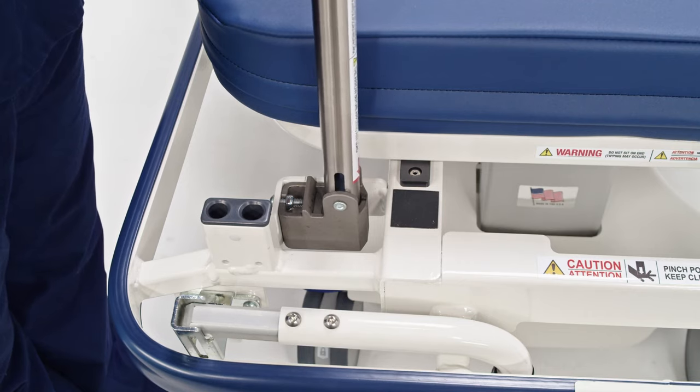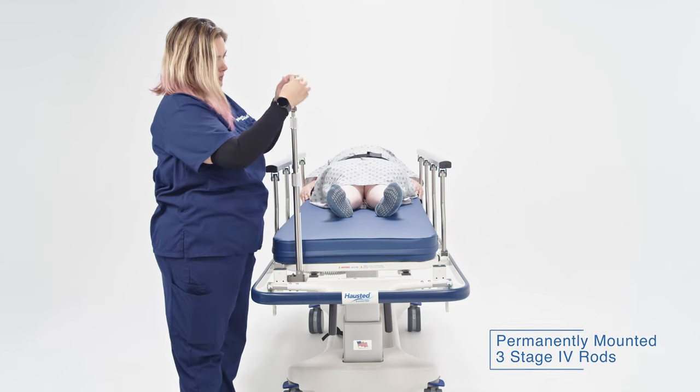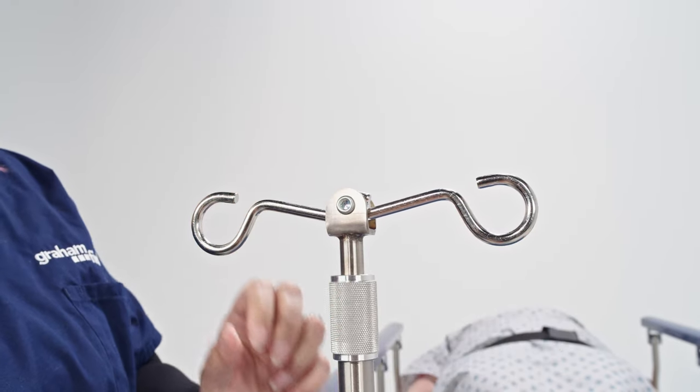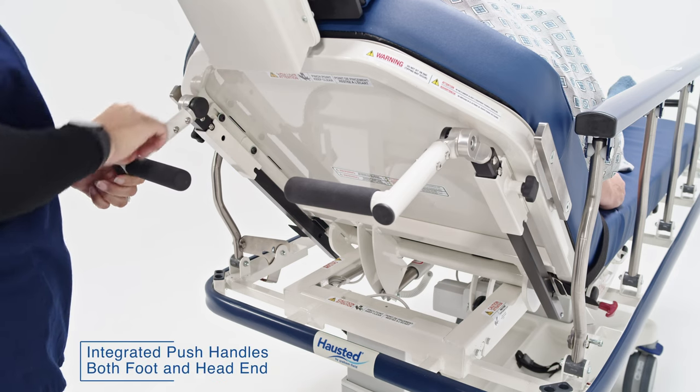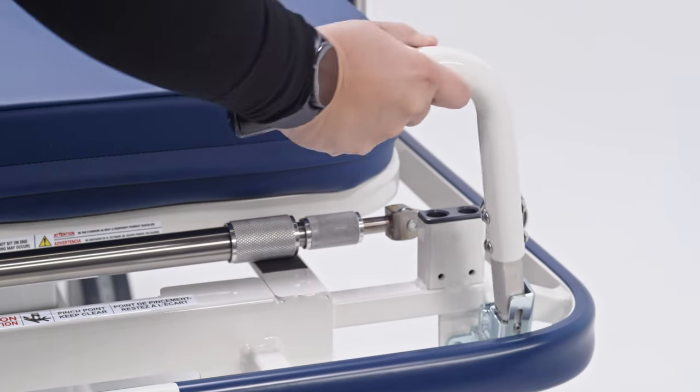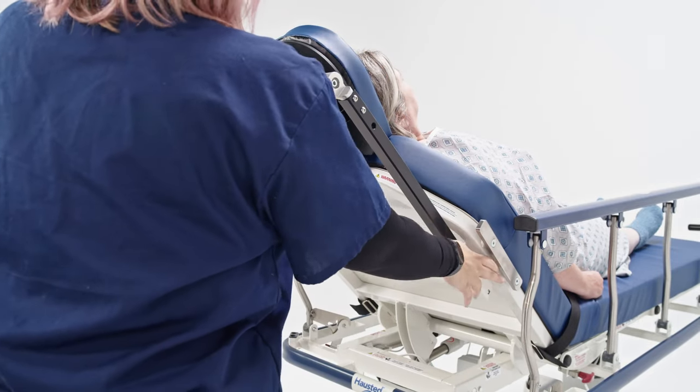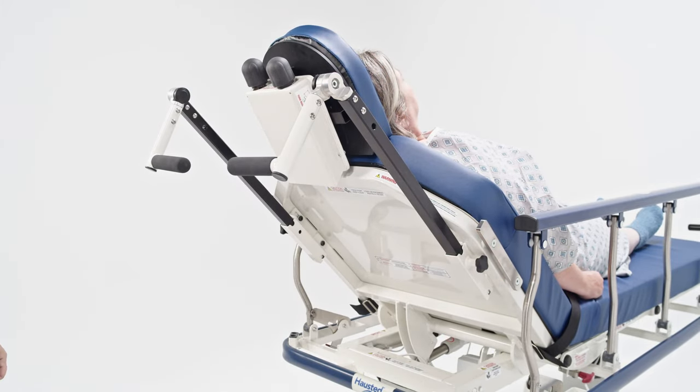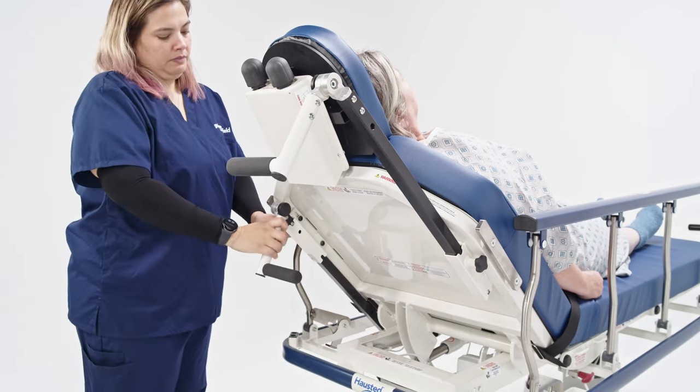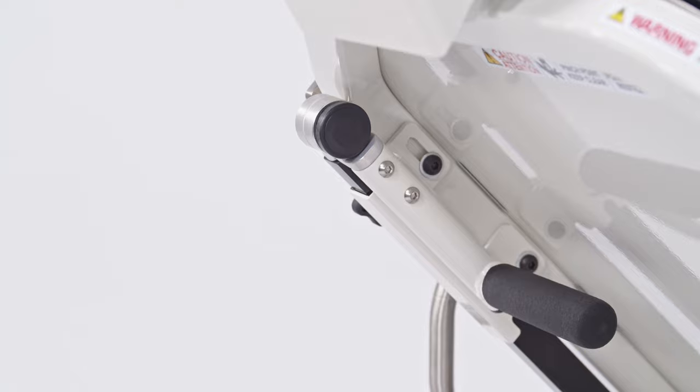Permanently mounted three-stage IV rods are located on the patient right foot end of the unit. Integrated push handles at both the foot and head end enhance staff safety. Handles can be raised or lowered to accommodate multiple height positions for proper ergonomic transportation. These are designed to stow out of the way when not in use, eliminating any negative impact on surgeon's leg clearance. The patient surface comes with an upgraded vinyl pad.